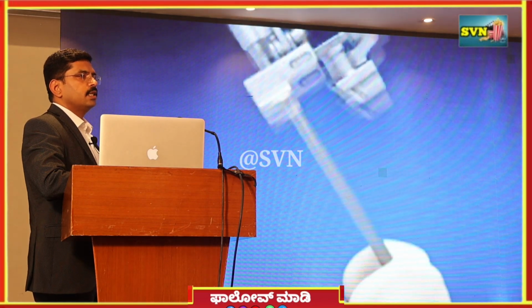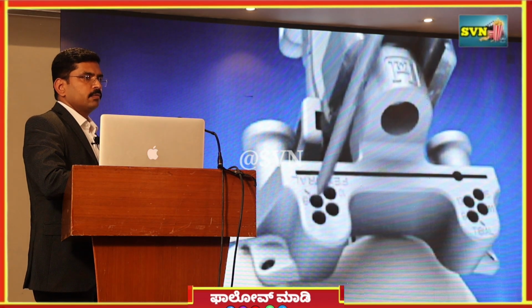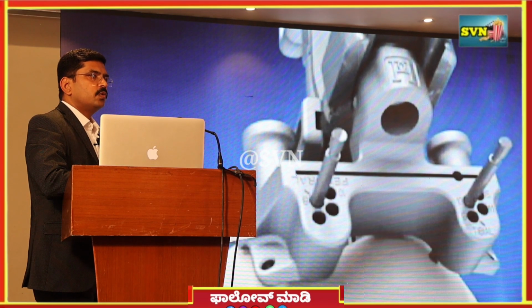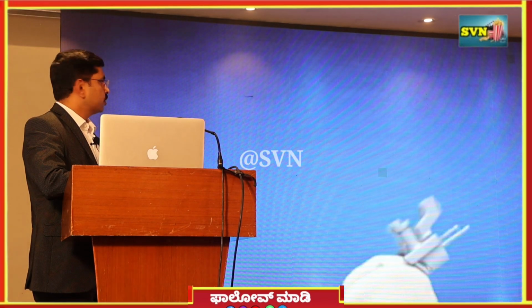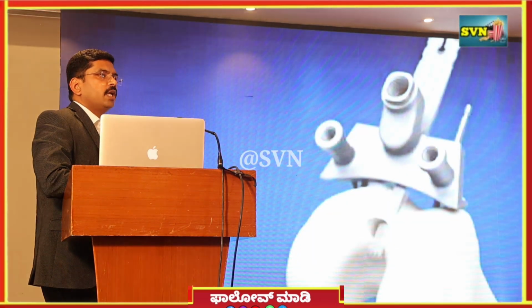Since this person has an implant inside, I cannot put a rod inside. So for that, I have to take his implants out. That is one more surgery. At his age, definitely more challenging. I need to take his implant out, wait for the wound to heal. Once that is healed, then I have to progress for the next surgery. So since I have robo, I have the advantage of doing the surgery without taking the implants out.